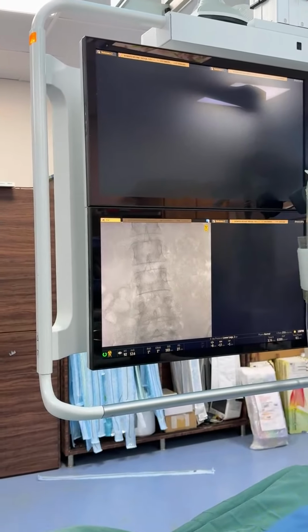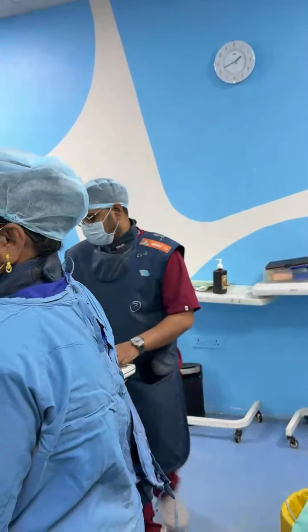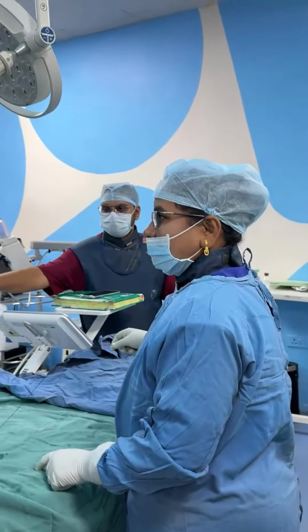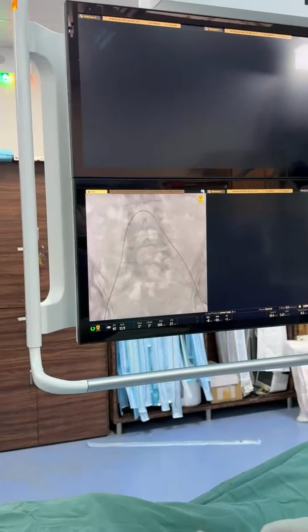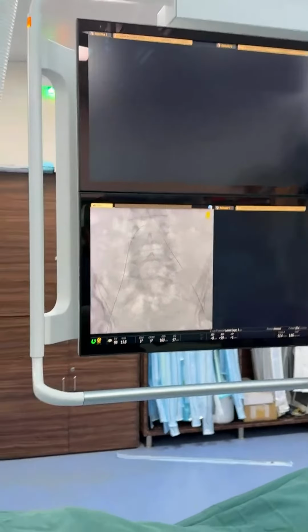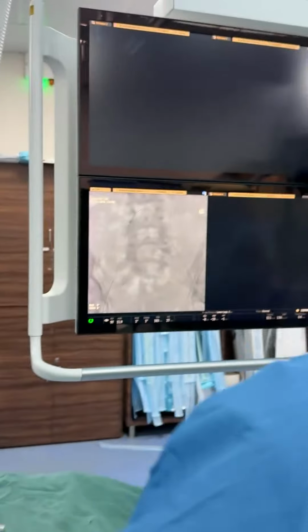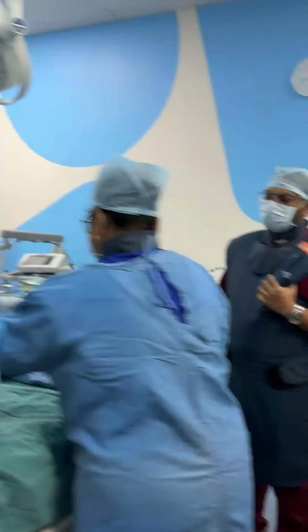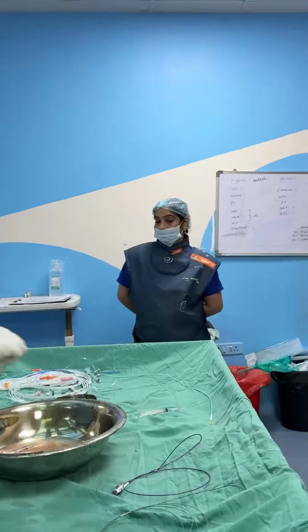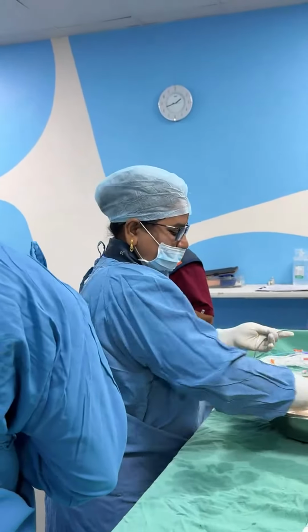So, we have Parvati today. Table please. Parvati is assisting me today, and then we have Prasad, who is the technologist, cath technologist. We have Gauri, and then we have smart boy Srinu. After a long time, so get me that.